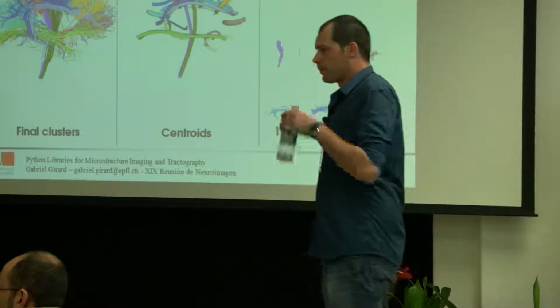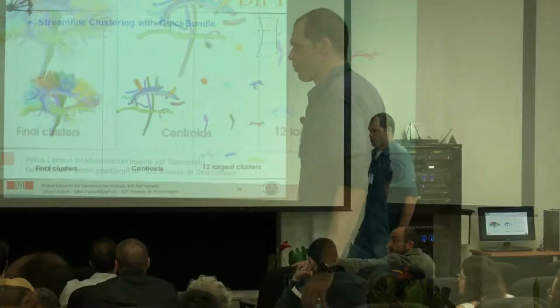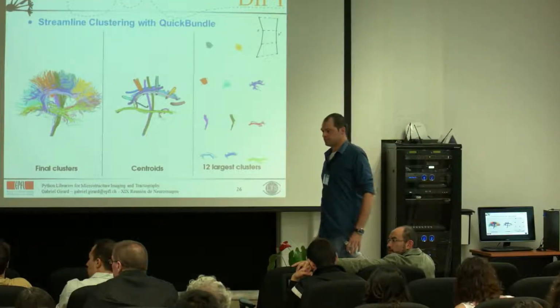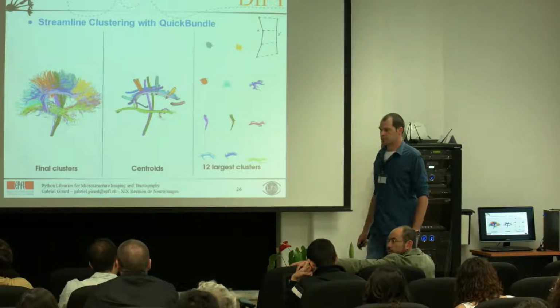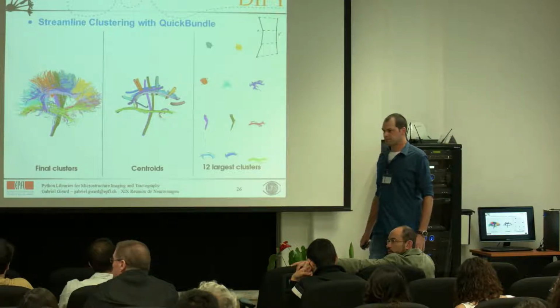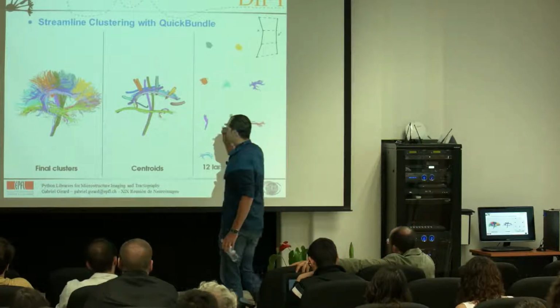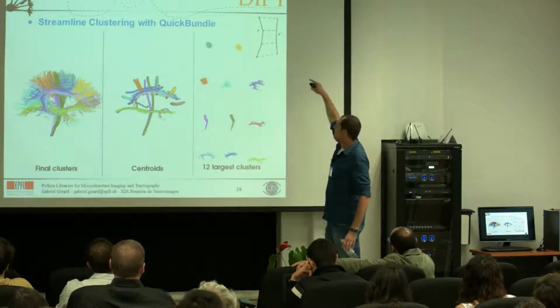And a similar question, if you're in this case where your own tractogram starts to find the clusters, can you find the weight or the distance of a particular streamline to any given cluster, and that way remove any lines that are really not that? You have access to this information, but the way the algorithm works is you fix a distance, and the distance that is used is called the MDF distance.